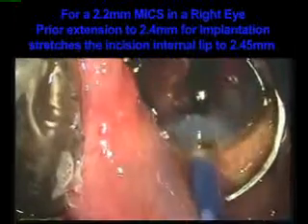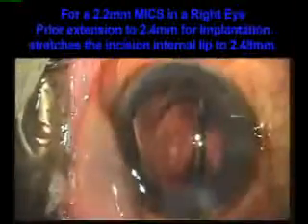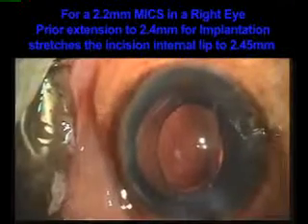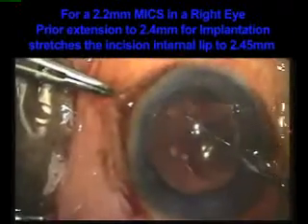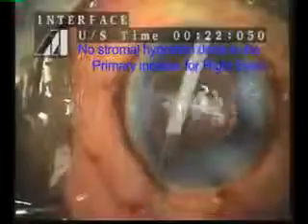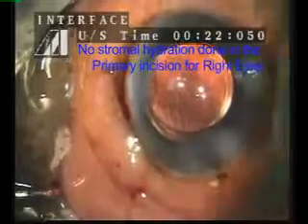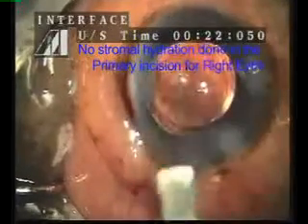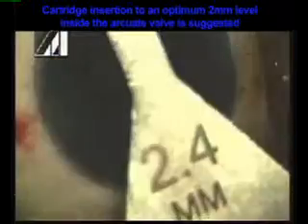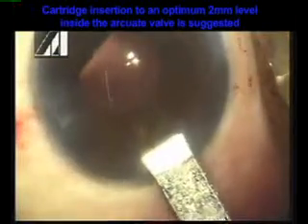This procedure of extending is strongly recommended so as to facilitate a comfort zone for the surgeon to position the distal end of the cartridge tip with more grip in the arcuate corneal valve created. When micro-incisions are measured after lens implantation, the overall width was observed to remain at 2.5 mm or even less in both the groups, which is an accepted incision size for not inducing any surgical astigmatism.